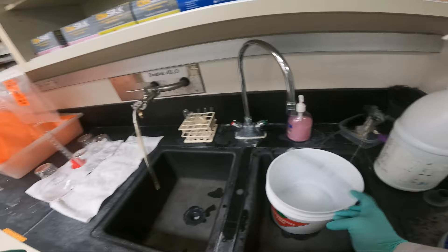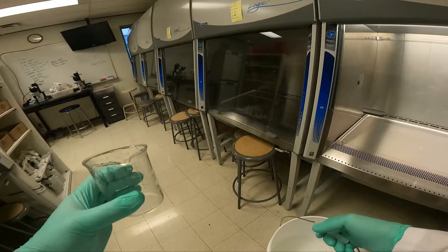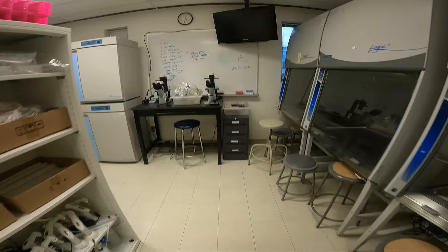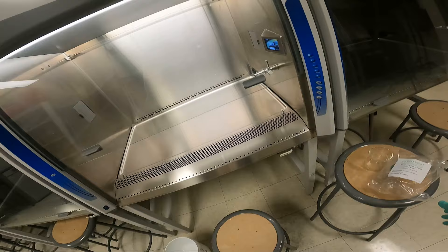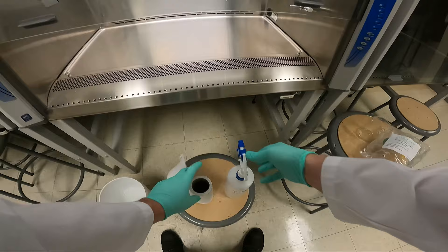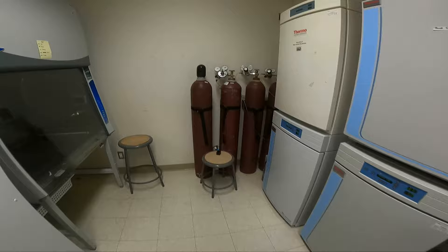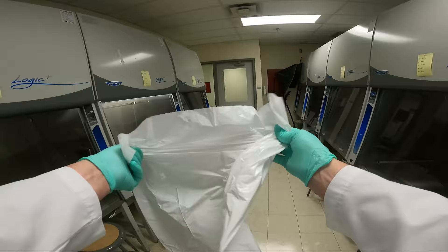I also always use a 250ml beaker as a waste beaker. The reason why I'm setting up the hood now is for sterile filtration — here I obtain a 150ml sterile filter. Trypsin cannot be autoclaved to sterilize; it will denature the protein. As a result, it must be sterile filtered. We must wait for the 'please wait' symbol on the screen to disappear before we can start working in the hood. We'll get a plastic bag for any non-contaminated paper products we might have, and tape that to the side of the hood.